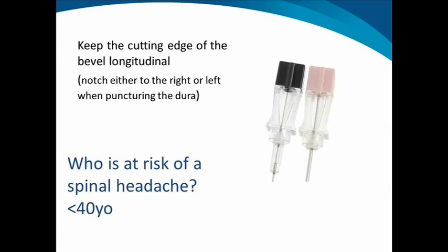I'll talk on a few slides about the risk of spinal headache. This is often one of the most popular questions that patients have prior to the procedure. They read online that this is a painful procedure and that you can get a headache afterward, and they are correct to some degree. Anytime we puncture the thecal sac and enter the subarachnoid space, there is a risk of a spinal headache. In our relatively vast experience here at the New England Baptist Hospital, patients who are over age 40 rarely get spinal headache.